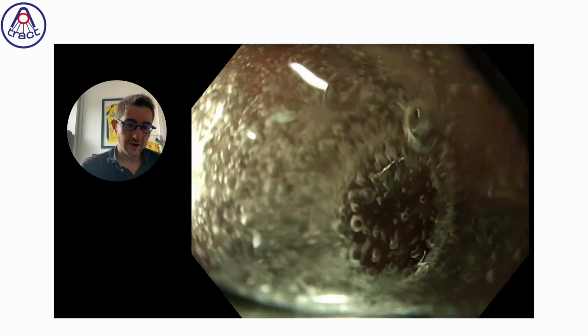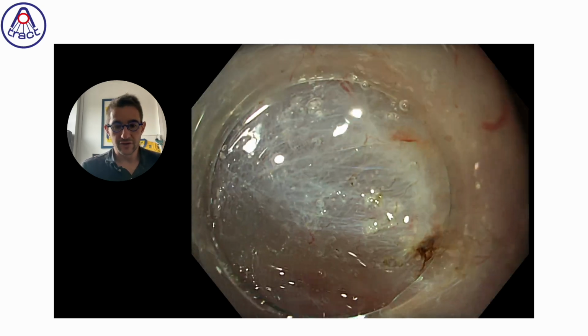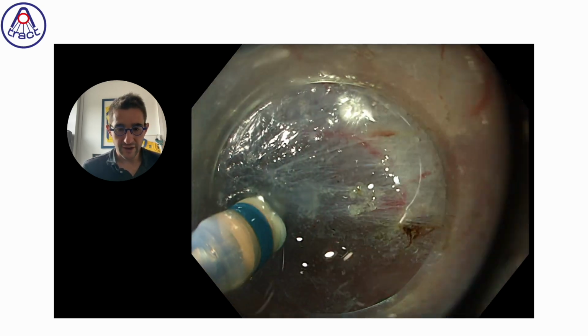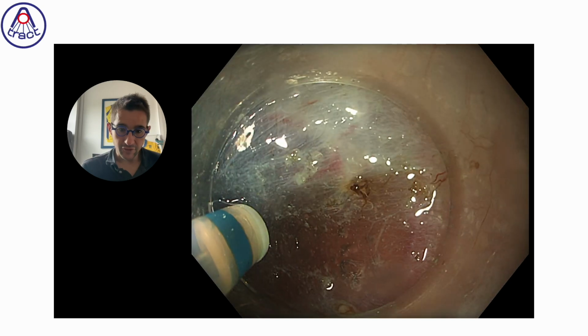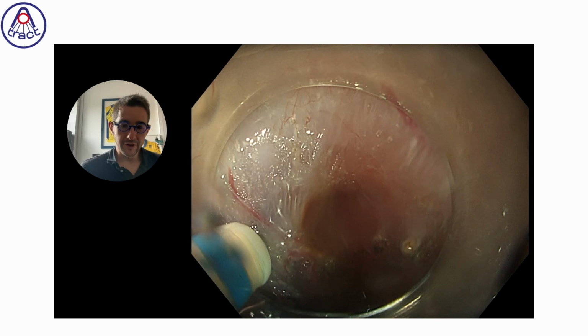It seems that we are going under. Once again, underwater helps to enter into the channel. We will try, because we are close to the muscle, to stay very close to the muscle layer, to be deep enough.